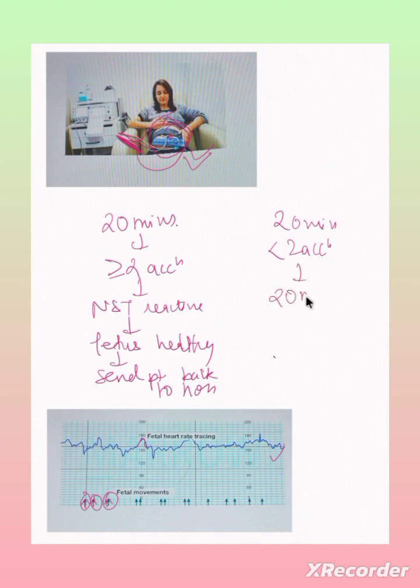So if in a total of 40 minutes, again I get less than 2 accelerations, then I will say NST is non-reactive, not initially.